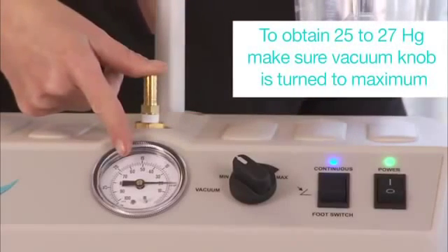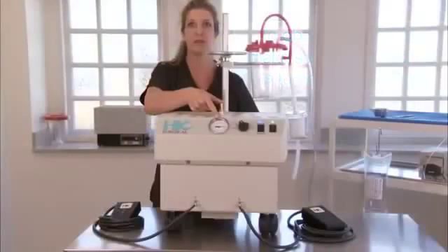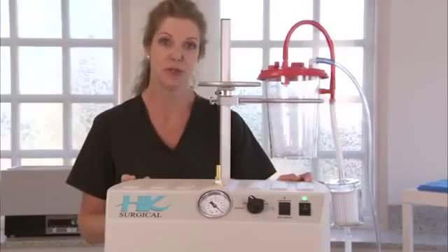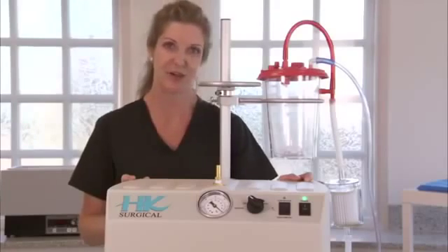If the suction dial reads 25 to 27, then the unit is functioning properly. Now you must double check your disposable components to determine where you are losing suction from.